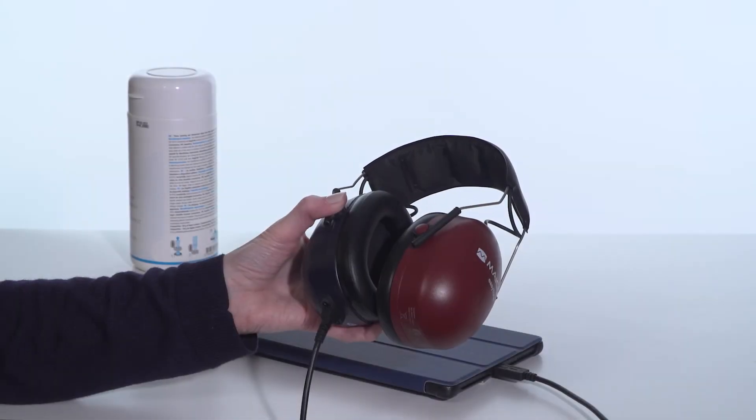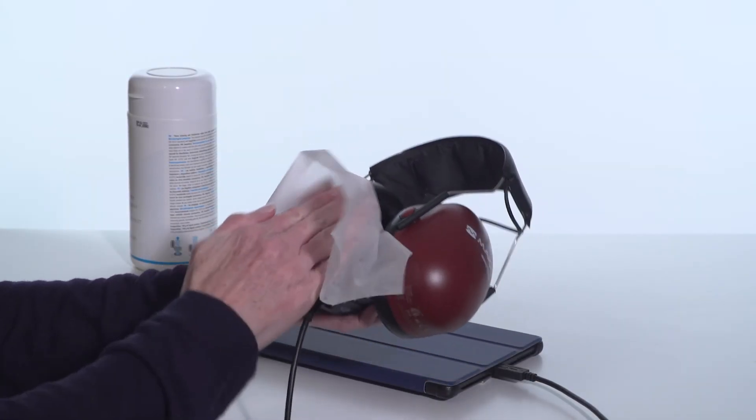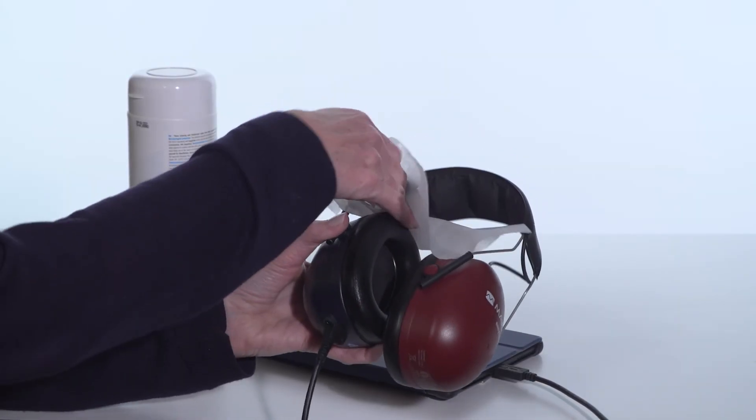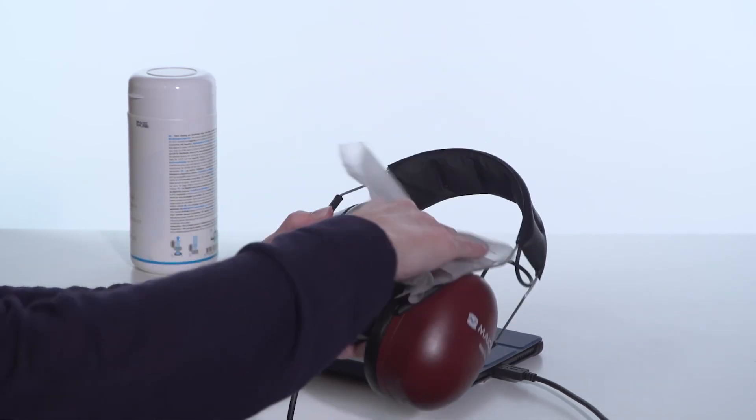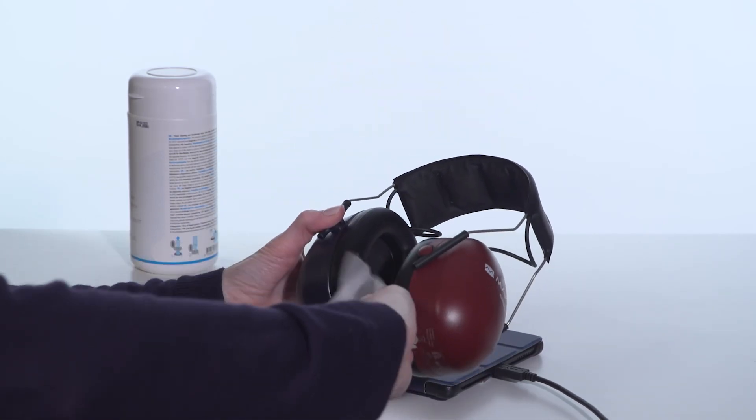After the test, wipe down the headphones and any portion that came into contact with the subject with a disinfectant wipe.